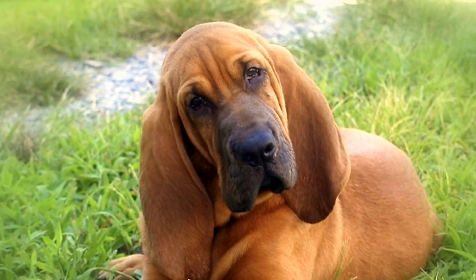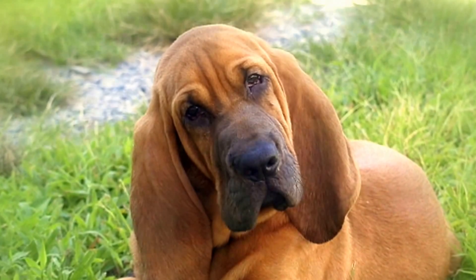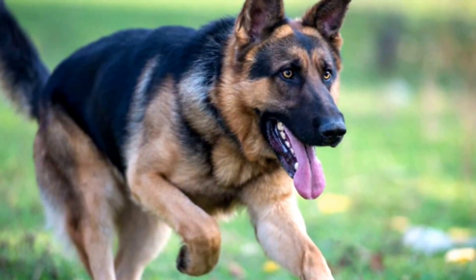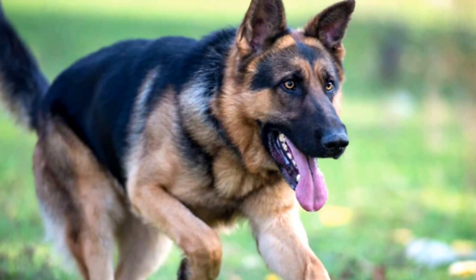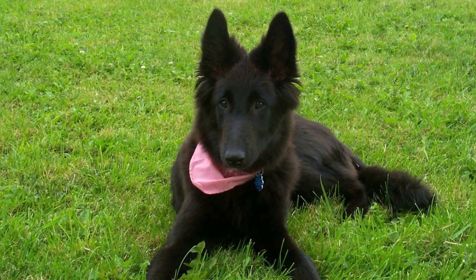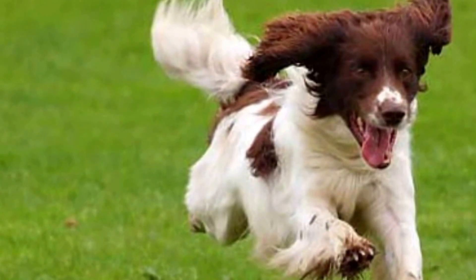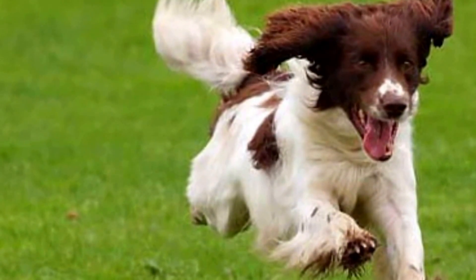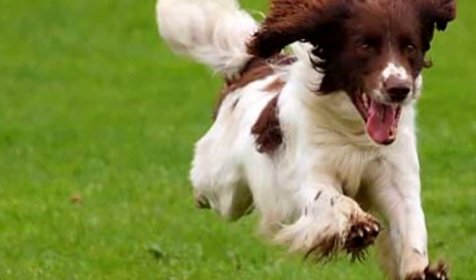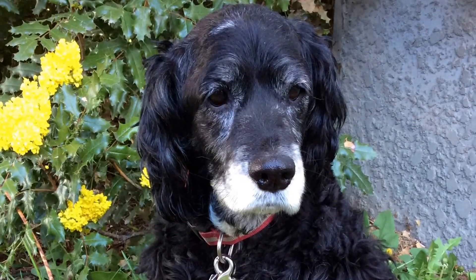There are many benefits of the PennHip method over the traditional OFA view. First, you can do an evaluation at four months of age before they are at breeding age. It's a numerical, objective method with no bias from the evaluator. Lastly, your dog's results are compared against a huge database of dogs of the same breed. This allows you to make good breeding decisions and good care decisions if you know the propensity for arthritis.